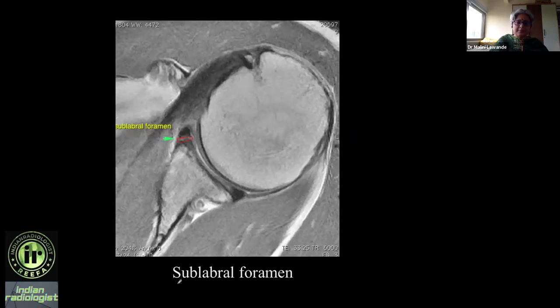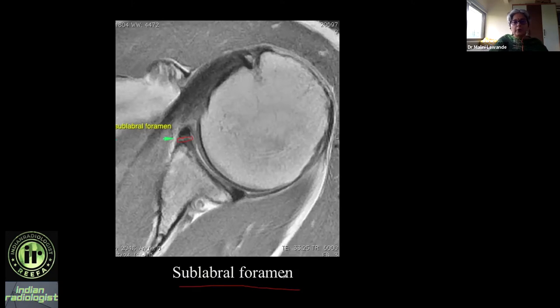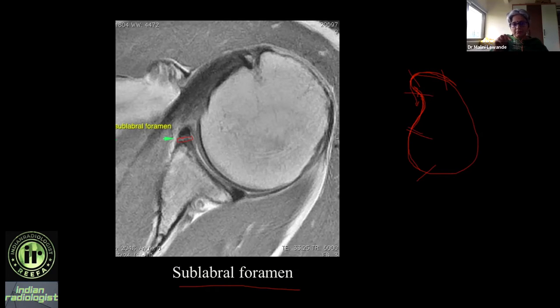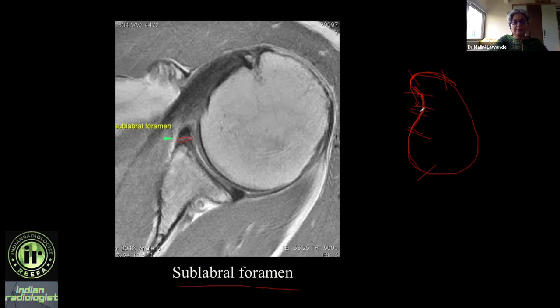Sometimes there's a cleft at the base of the anterior superior labrum. Is it a sublabral foramen — a normal variant where the anterior superior labrum is not tightly attached — or is it a tear? One key point: you usually do not get isolated anterior superior labral tears. It's typically an anterior inferior tear or Bankart extending superiorly, or a SLAP extending inferiorly. If the rest of the labrum is normal, think sublabral foramen. It is seen in only two or three sections, with smooth, sharp margins.